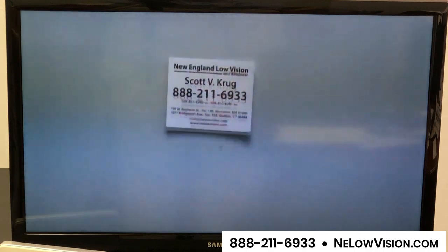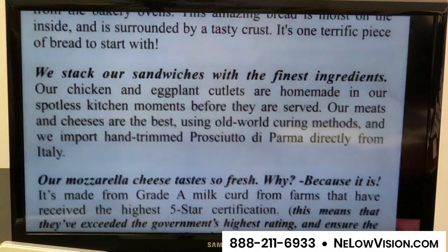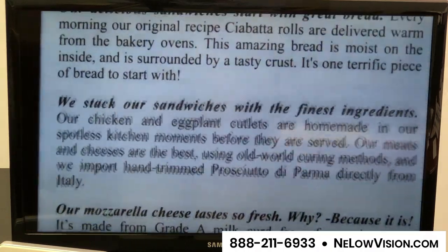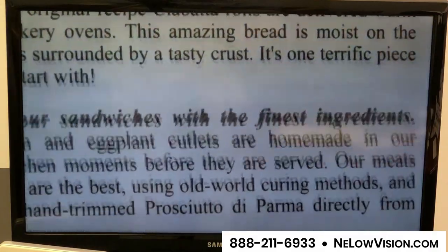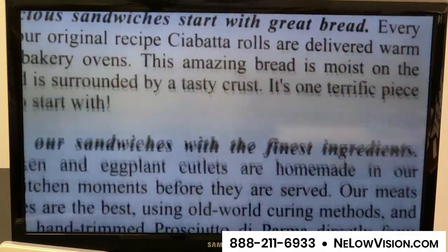It's also great for holding things in your hand and reading up close — here I have a menu and that will focus in, and I can make the image bigger and change the backgrounds as I showed you before. It really gives you a nice, clear image, and the glasses are so lightweight.